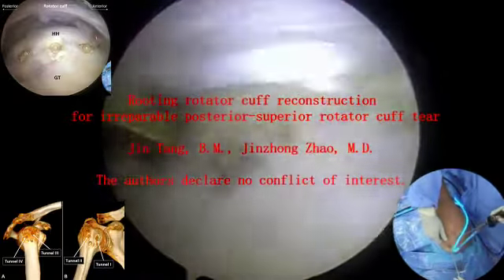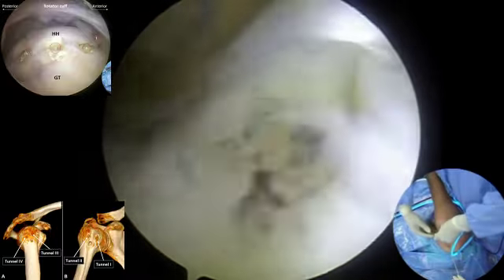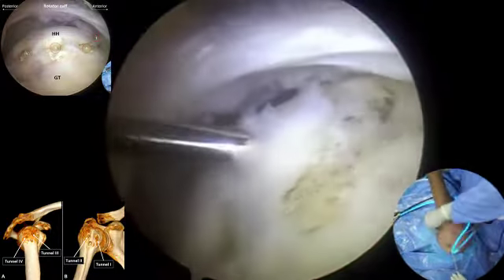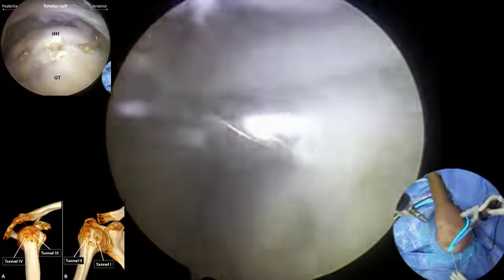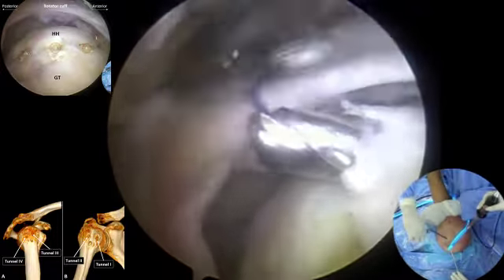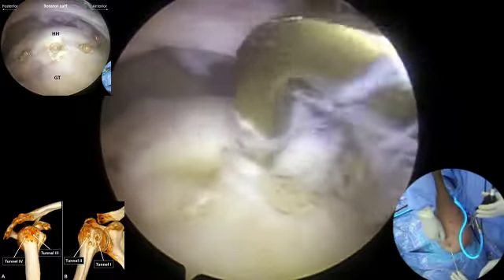This procedure is performed in the right shoulder. The arthroscope is placed in through the mid-lateral portal, and the bone tunnel aiming device is placed in through an accessory anterior-lateral portal. Tunnel 1 is created through the lesser tuberosity traversing at the anterior edge of the bicipital groove. Tunnel 2 is created through the greater tuberosity traversing at the posterior edge of the bicipital groove. Guide sutures are placed in through the tunnels.